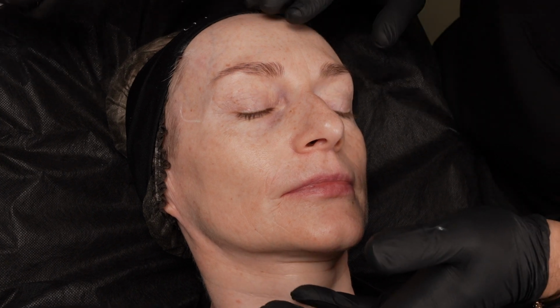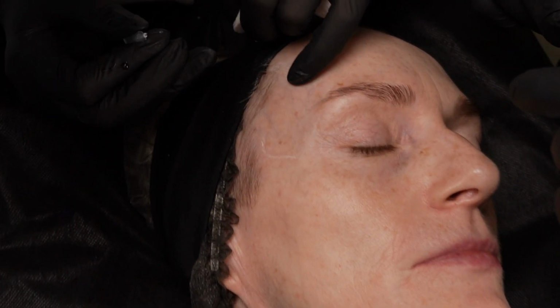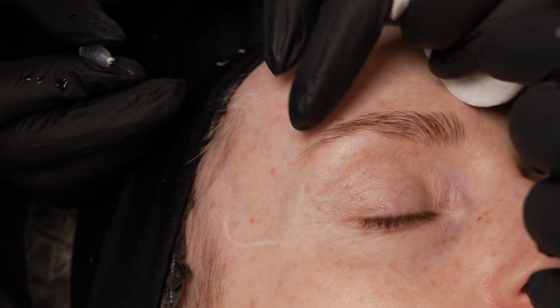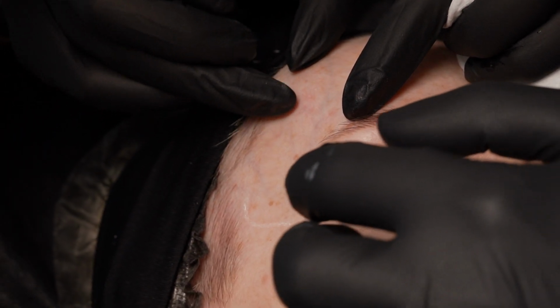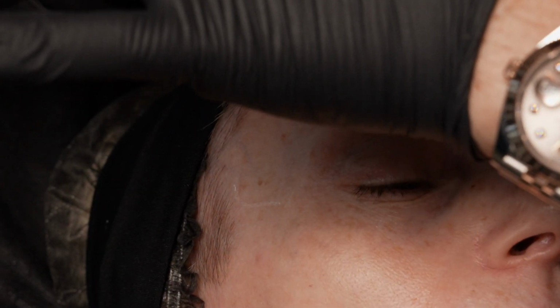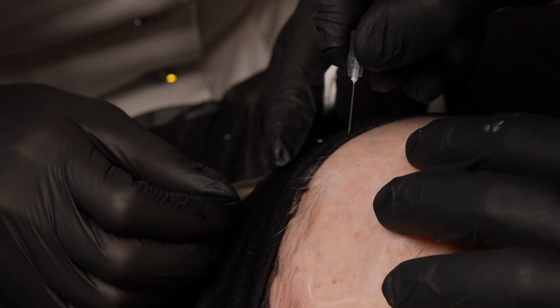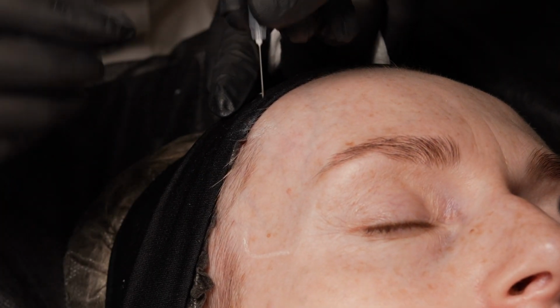So be careful of the veins. Yes, this is a vein. For example, you can open it. I will show it. I think here, or here.